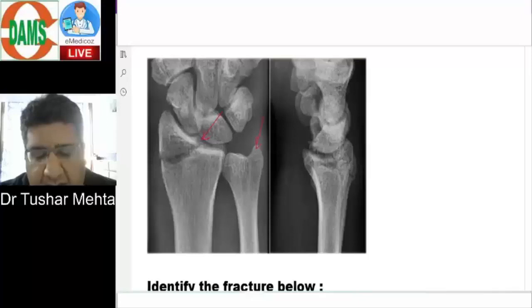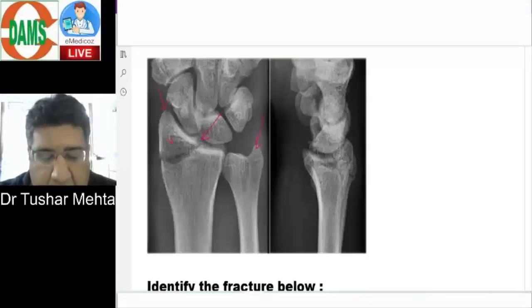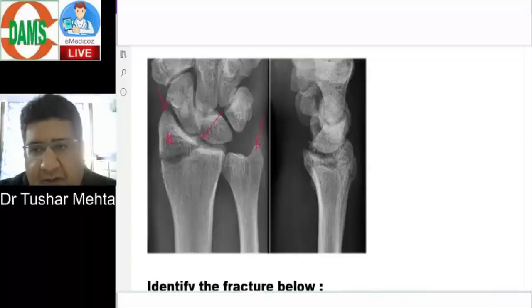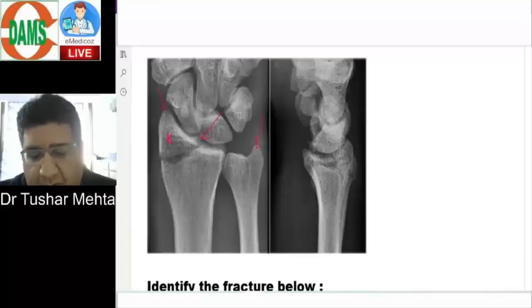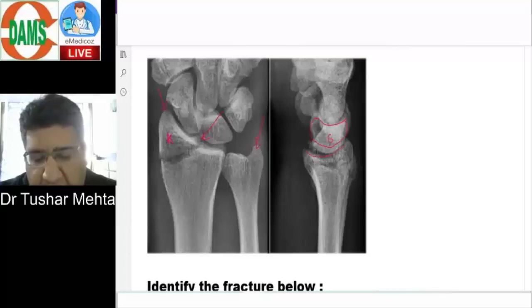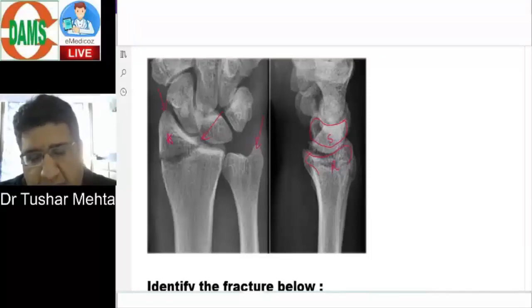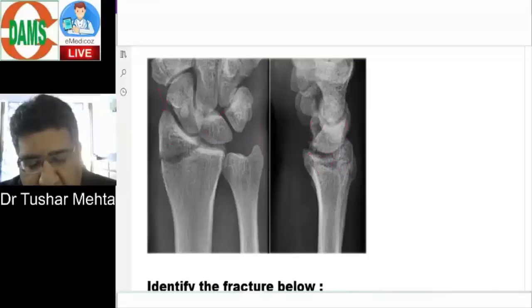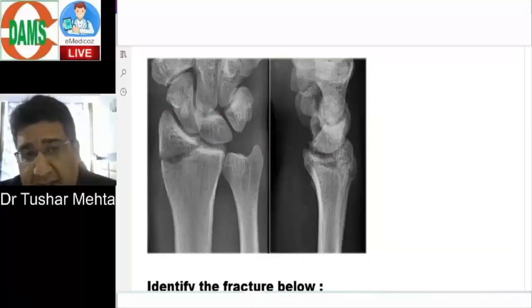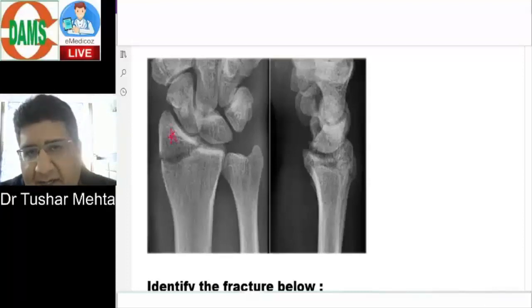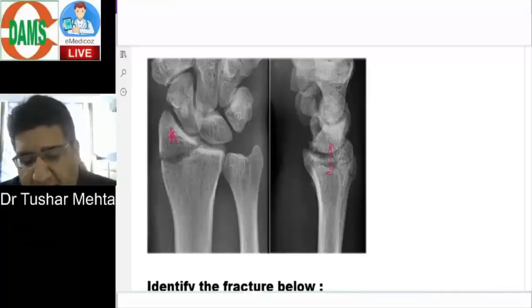This is the ulnar styloid, this is the radial styloid, and you can see a discrete radial styloid bony fragment. Scaphoid is a bone — the term comes from the word 'scapho,' meaning boat, so it is a boat-shaped bone. You can see the shadow in the lateral view. Looking at the relationship between your scaphoid and distal end of the radius, the boat and the base are well fitting into each other — there is intact radial-scaphoid joint anatomy.